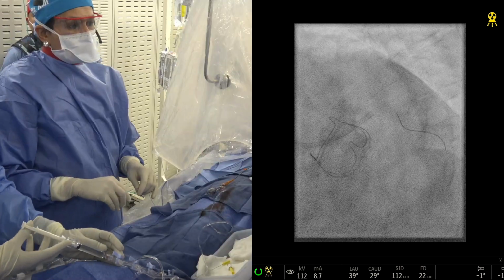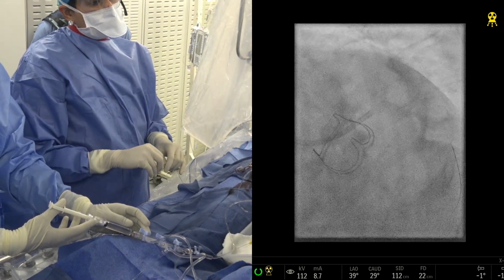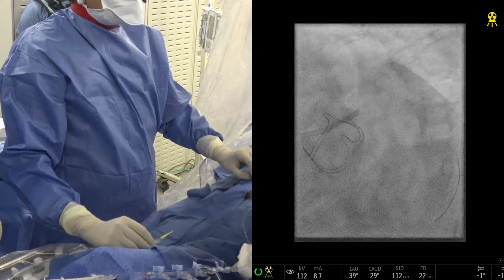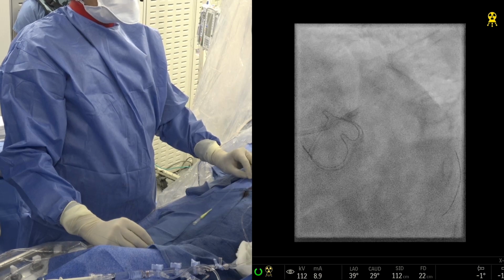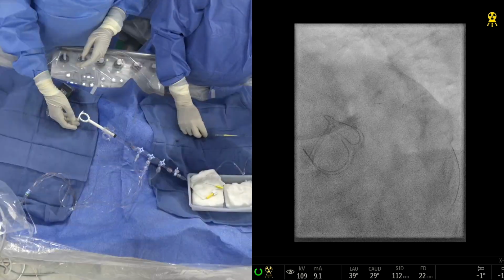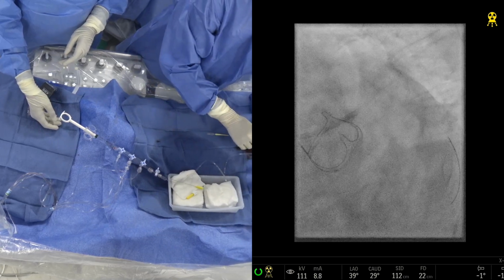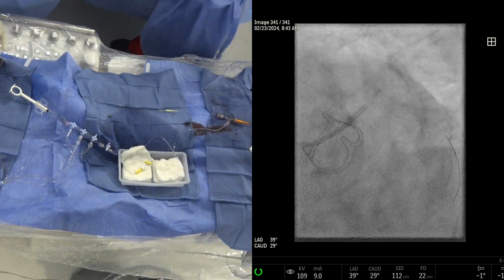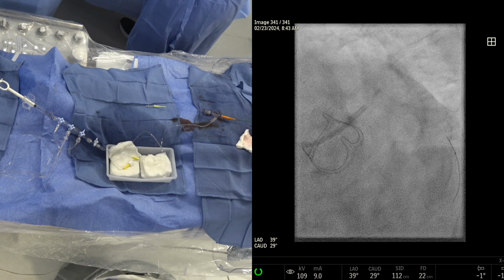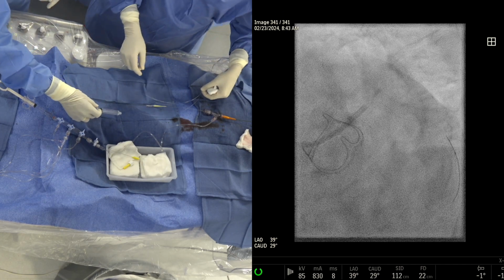Let's do the IVUS on this now. Speak loudly so everybody can hear. What's your plan? Let's see if the IVUS will go on the rotawire. Yes, sure. We are going to put the IVUS on the rotawire there. Why do you need IVUS here for the circumflex? I think we just wanted to see the calcific nodule, how it looks, and what change the atherectomy is going to make.